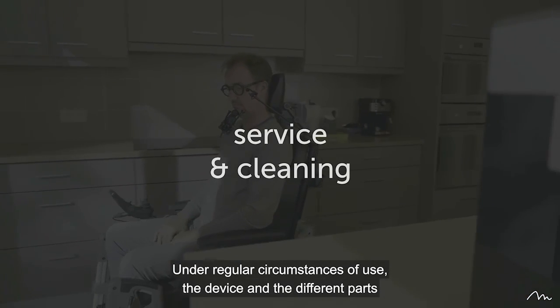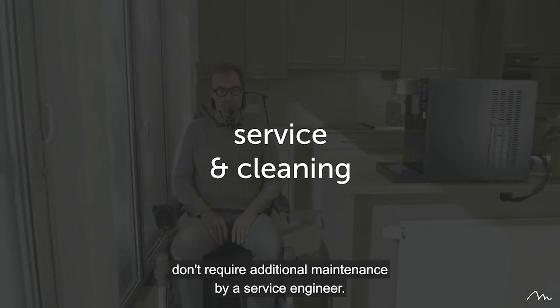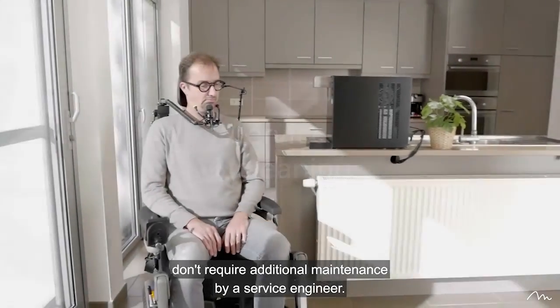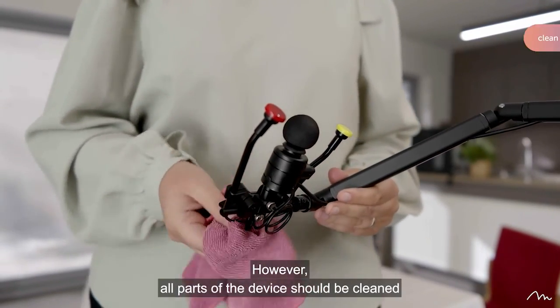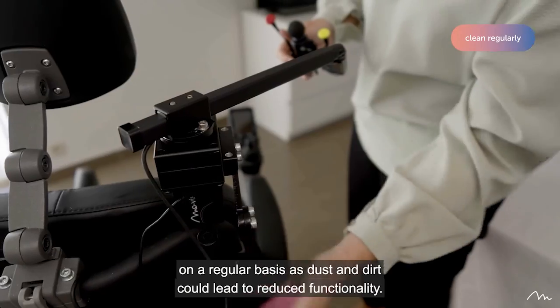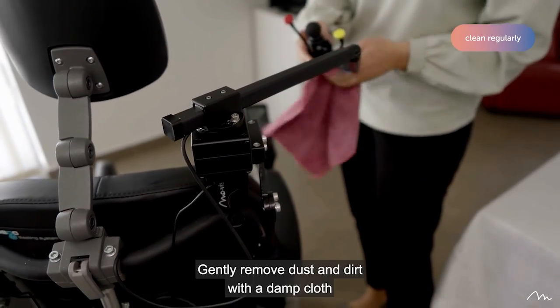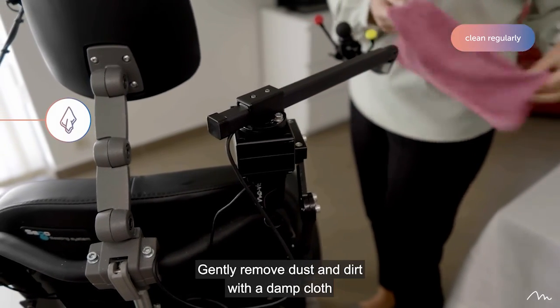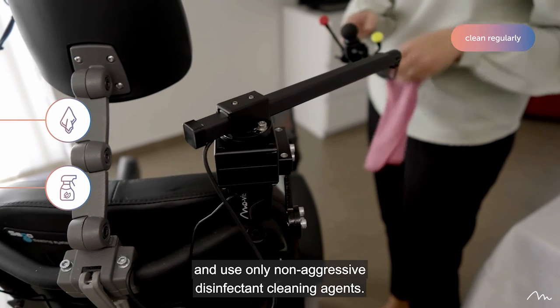Under regular circumstances of use, the device and the different parts don't require additional maintenance by a service engineer. However, all parts of the device should be cleaned on a regular basis, as dust and dirt could lead to reduced functionality. Gently remove dust and dirt with a damp cloth and use only non-aggressive disinfectant cleaning agents.